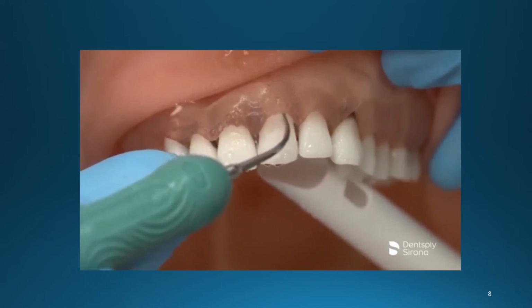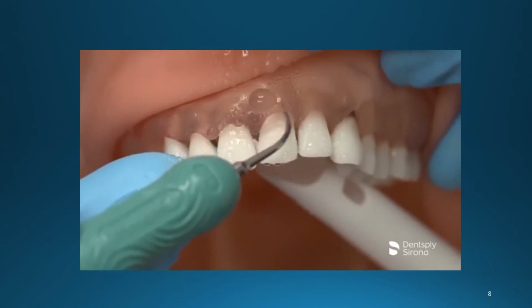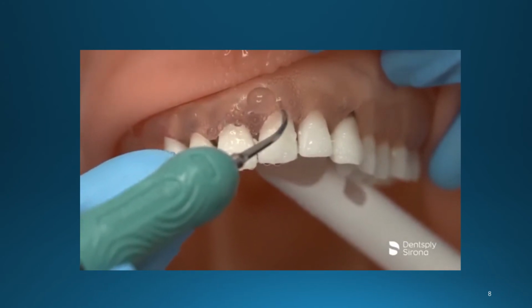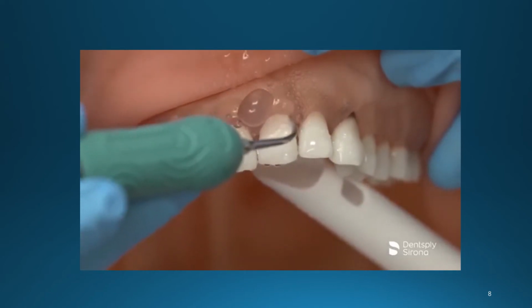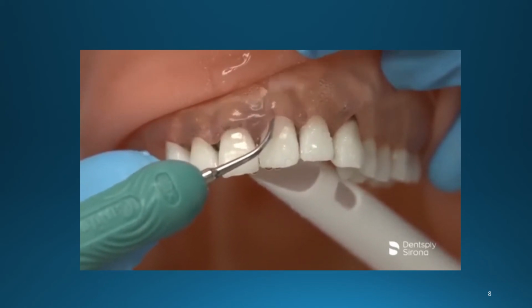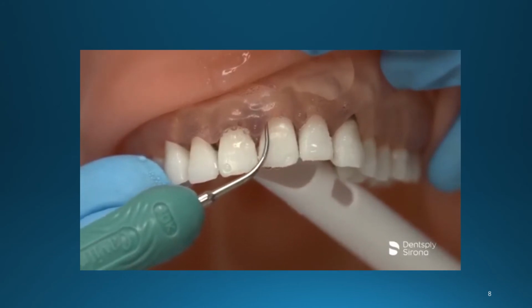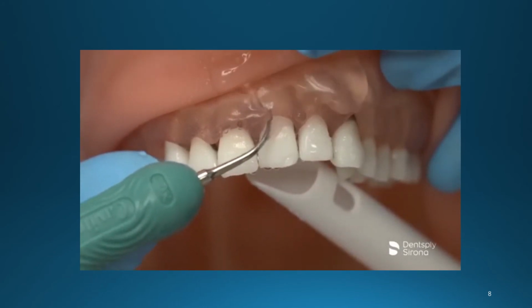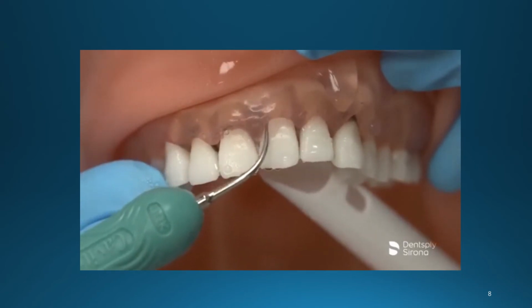It is imperative to ensure the complete removal by producing a stroke pattern that is overlapping and methodical. Haphazard strokes will leave the surface incomplete, contaminated, allow for biofilm to attach, and harbor the pathogens we are attempting to rid from the pocket. As the clinician moves toward the interproximal area, it is important to angulate the insert so that 2 to 3 millimeters of the terminal end is always adapted.